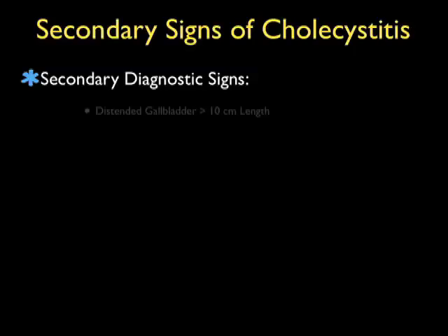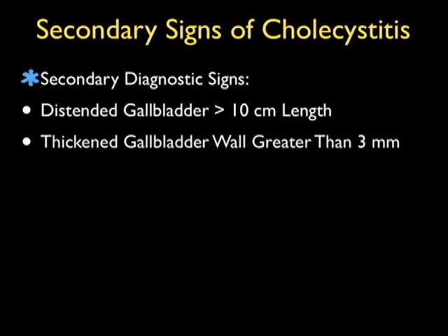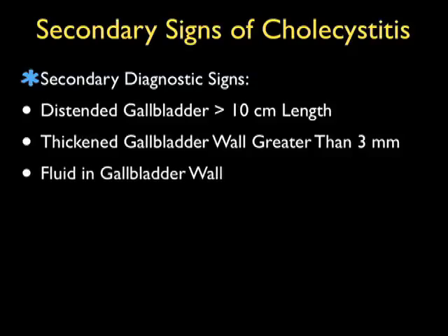There are multiple secondary signs of cholecystitis that we should go through. These include a distended gallbladder greater than 10 cm in length, a thickened gallbladder wall that's usually mentioned as greater than 3 mm in width. Also, one may be able to see fluid in the gallbladder wall, or edema within the gallbladder wall, as shown by a stripe of fluid within the wall.